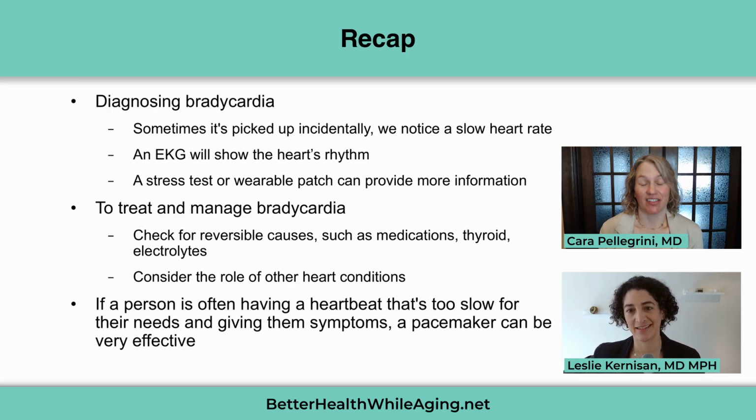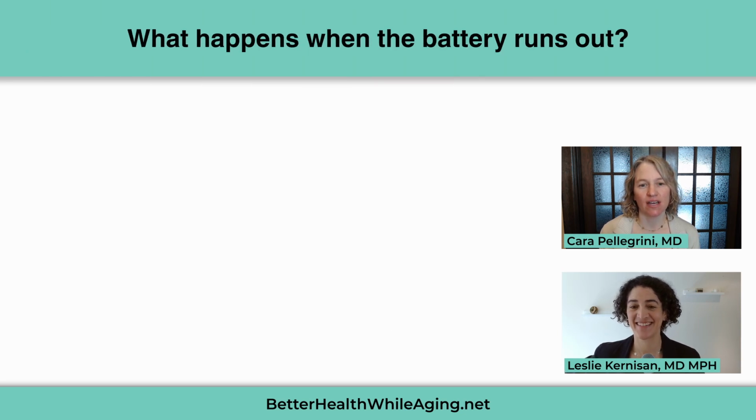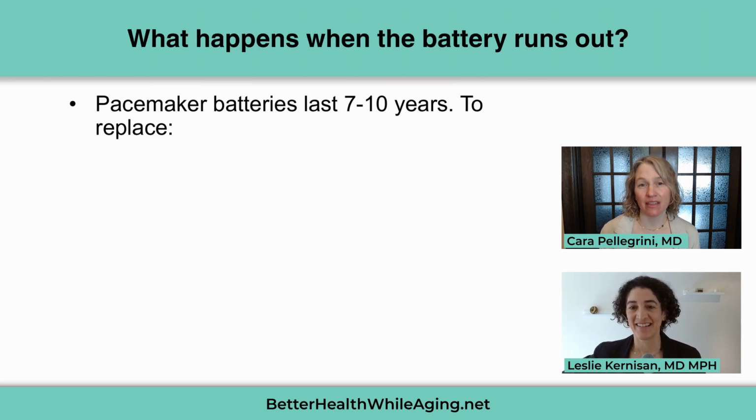Yeah, excellent recap. You covered a lot. There's a couple of things that I think might be of interest that I didn't get a chance to mention. One is, I mentioned that the battery on these devices lasts about 7 to 10 years, plus or minus, depending on how it's being used and exactly what kind of device you have. And so some people might be wondering, well, what happens then? At that point in time, we would do another procedure.